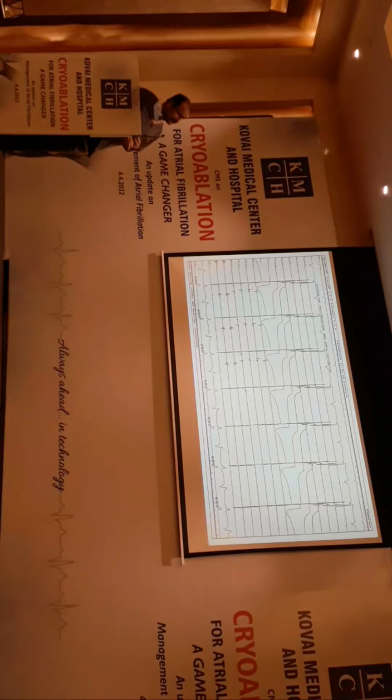In this patient, RSPV was the one which was firing. I think when I was moving the catheter, the RSPV was the one which was triggering the AF persistently, more recurrently. So that RSPV also isolated now.